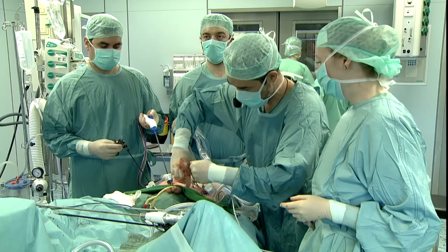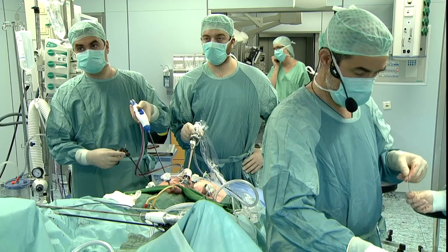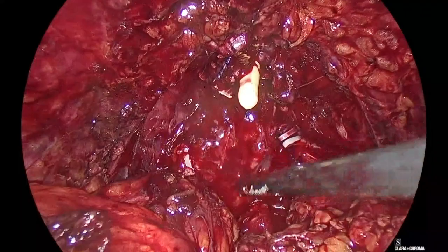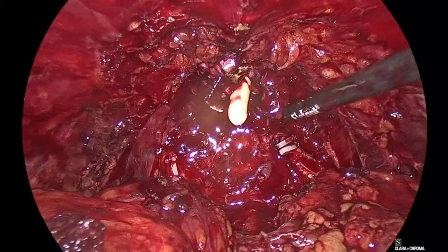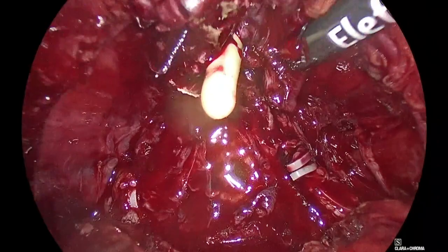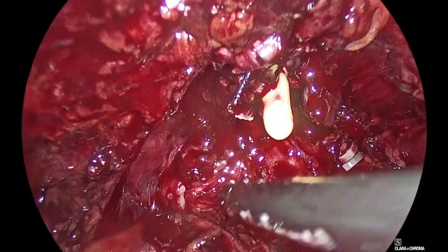Anastomosis suture. Let's check for hemostasis. We're okay. Bring the pressure down, please. Good. Let's fix the anastomotic stitch. Hold this for me here. Now I fix the anastomotic stitch. Give me a grasper. A mosquito or something. I use a PDS continuous, hold this, scissors, which I fix a bit on my table, around 15 centimeters each side. I don't know if you can see me outside. We need to go to the external view. I don't know if they can give you the external view, but I'm fixing this right now. Hold it, please. Nice. Hold it. Nice.